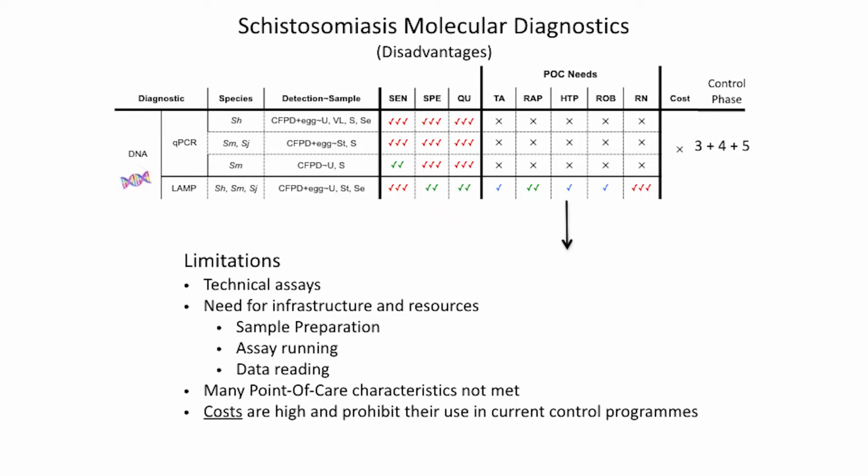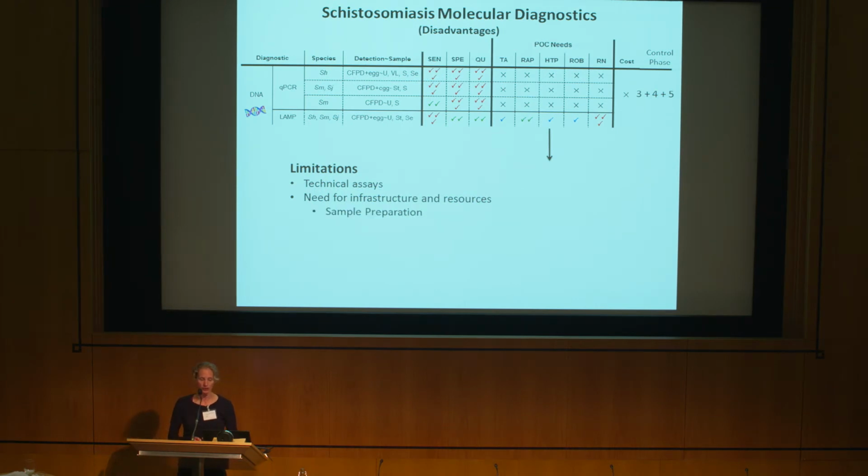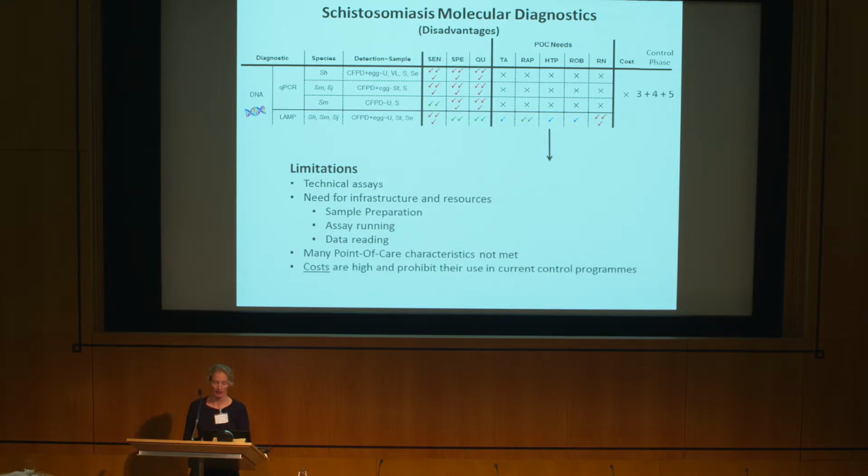But again, the limitations come down to this: these assays are highly technical. They need infrastructure and resources, and those resources are mainly due to sample preparation, the actual running of the assay, the equipment needed, and also then analysing the data. So many of these point-of-care characteristics are not actually met yet.